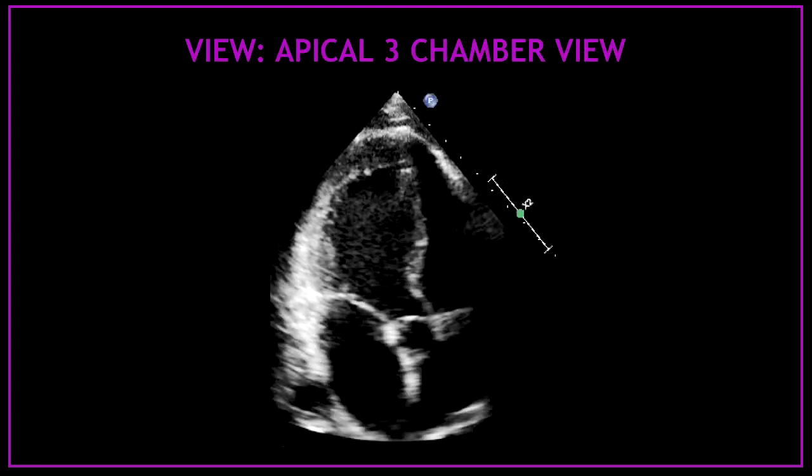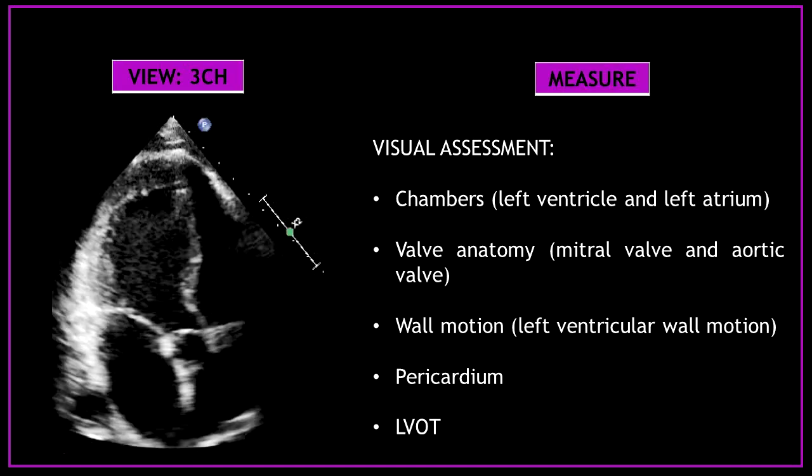Now let's continue with the apical 3 chamber view. First, obtain an apical 3 chamber view and perform a visual assessment of the cardiac chambers — the left ventricle and the left atrium. Also assess the mitral valve anatomy, aortic valve anatomy, and the left ventricular wall motion. Don't forget to have a look at the pericardium and the left ventricular outflow tract.